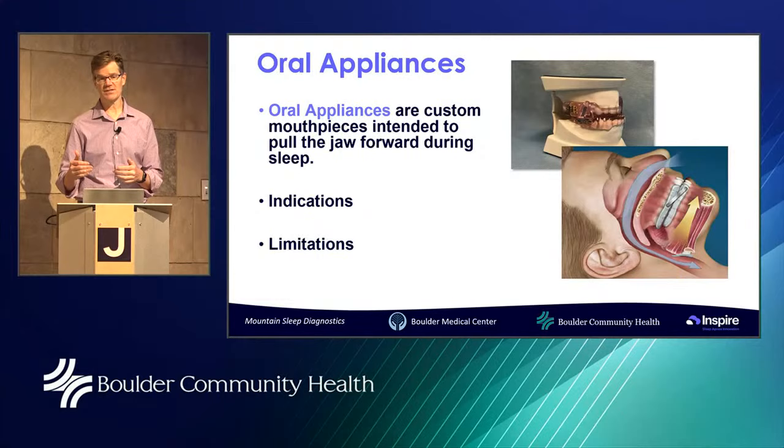So if we have a patient who has central sleep apnea, I'll often send them to the sleep lab. You have to go to the sleep lab to get an insurer to pay for ASV, adaptive servoventilation. It's 90% effective at treating sleep apnea. It's usually more comfortable for patients who have central sleep apnea. It kind of works with your breathing and syncs with your breathing. CPAP really doesn't sync with your breathing. It just kind of pushes the airway open. The adaptive servoventilation works a lot better.